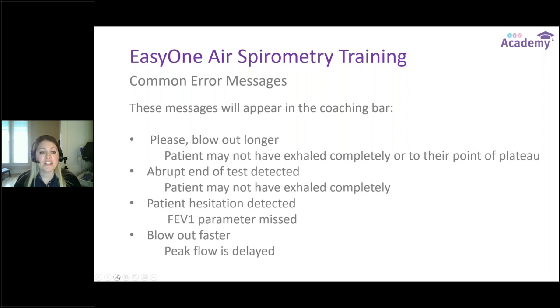Another very common error is Patient Hesitation Detected, which means we've missed the FEV1 parameter. Remember, FEV1 measures the air forcefully exhaled in the first second — so if the patient takes their big deep breath in and then hesitates before blasting out, we've missed that first second entirely, which is a very important parameter. I always say it's like playing a violin: big breath in, immediate breath out, one solid motion.